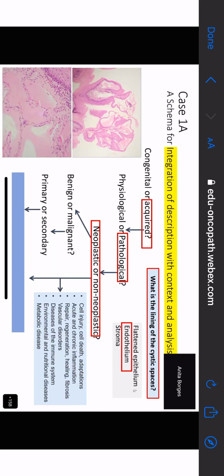But whether neoplastic or non-neoplastic, is this malignant or benign? It's benign. It can be either benign neoplastic or the result of some kind of vascular disorder. And when I say vascular, I don't mean blood vessels, I mean lymphatic vessels. It can be one or the other.